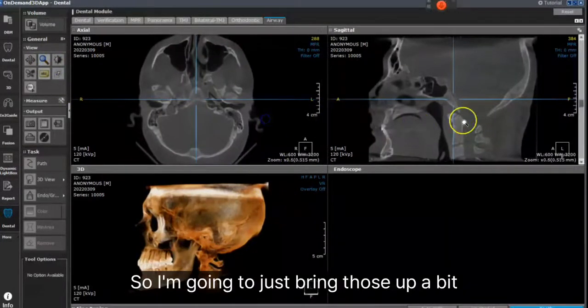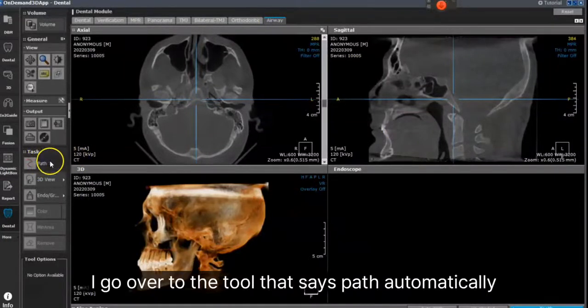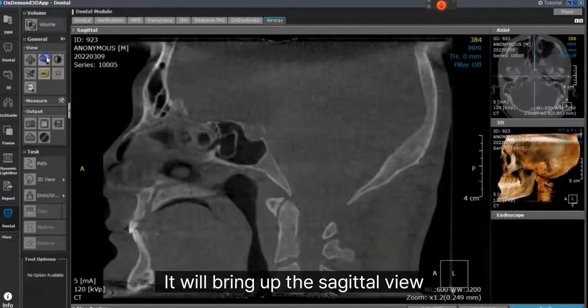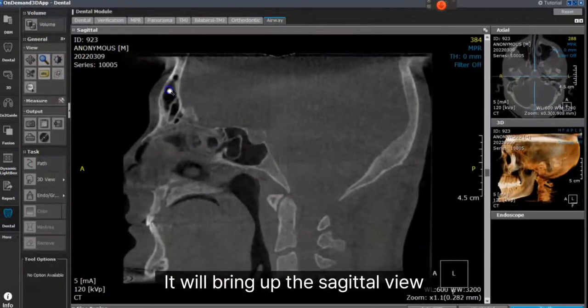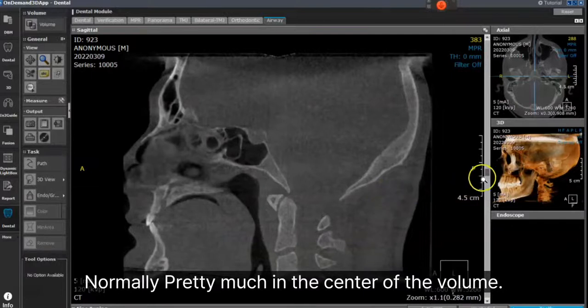I'm going to bring those up a bit, and when I click Airway, I go over to the tool that says Path, and automatically it will bring up the sagittal view, normally pretty much in the center of the volume.